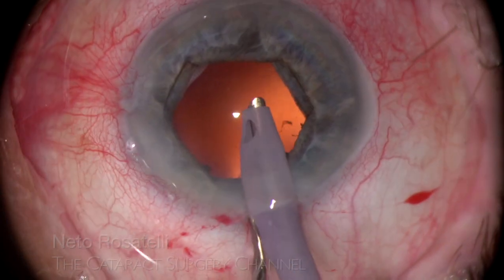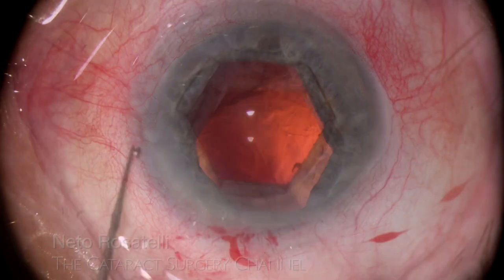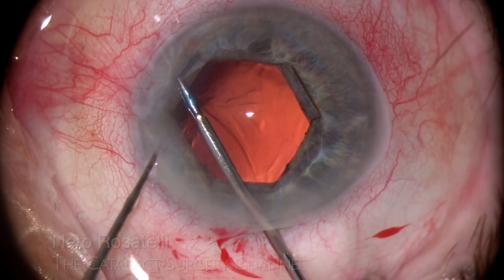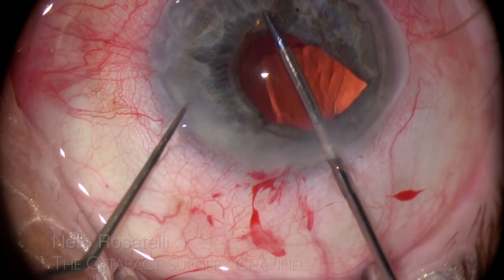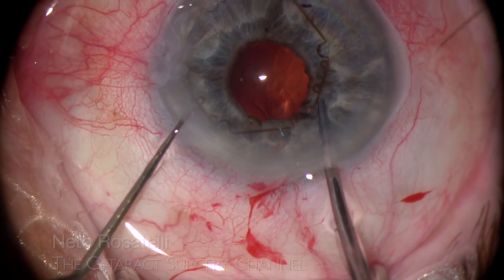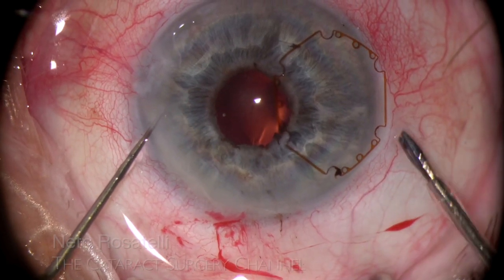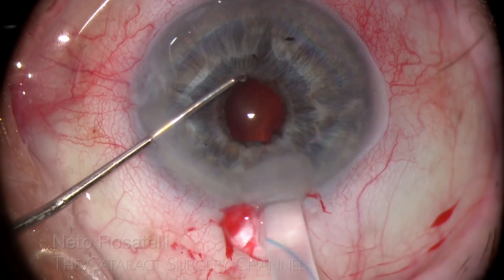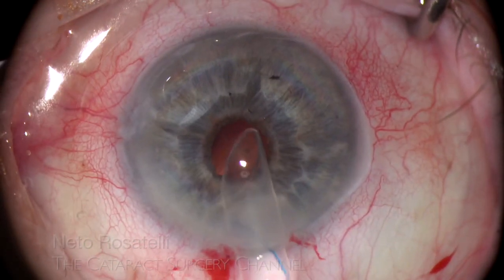OVD is injected before withdrawing the phaco probe to prevent anterior hyaloid rupture. I then proceed to remove the B-hex ring, which has performed its task wonderfully and unobtrusively and is not needed anymore. I am able to disengage the device from the pupil with one grasp and removal through the incision is very straightforward. The presence of an intact hyaloid is a great positive thing in this case and I opt to do an IOL iris fixation procedure in order to preserve it. Other techniques such as Yamane or other scleral fixation techniques would inevitably invade vitreous space.